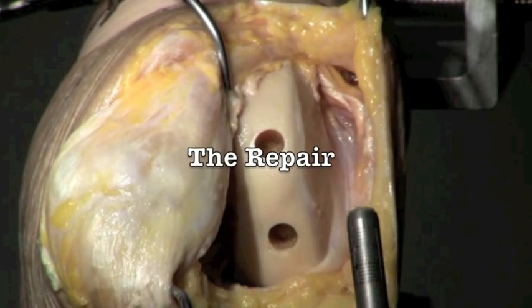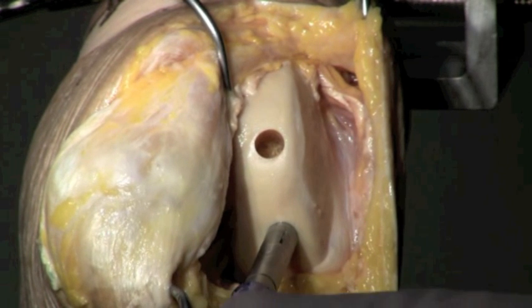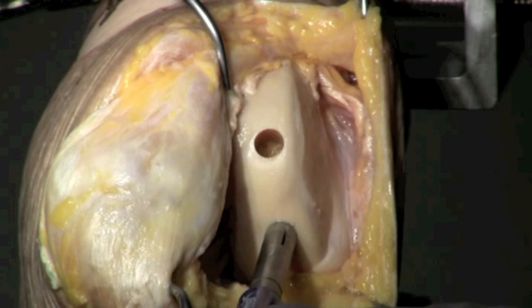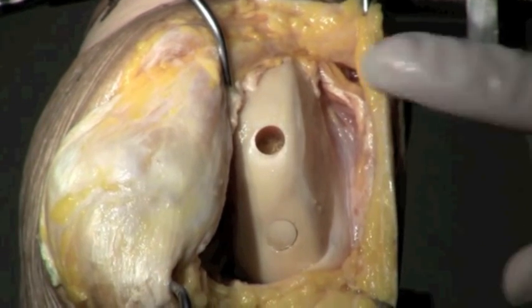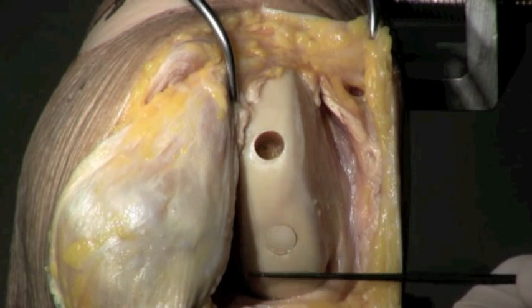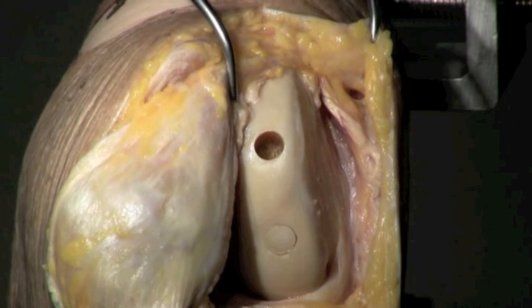So this is our donor. We're ready to fill the site where the cartilage was bad, and we're going to try to approximate the same angle. We've marked it in all of our quadrants so that we know about our depth, so that we can make sure that we reproduce that surface cartilage as accurately as we possibly can. So you can see right here, we've now repaired that cartilage. It's nice and smooth, and it doesn't stick out, but it's not recessed either. That's just about how we want it.